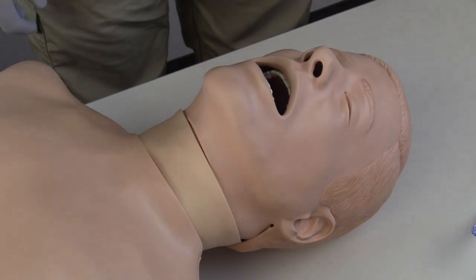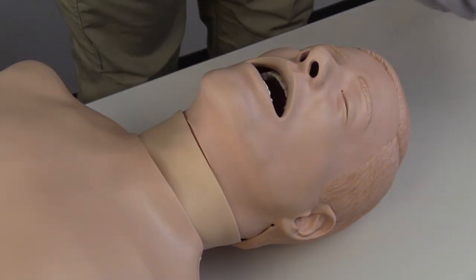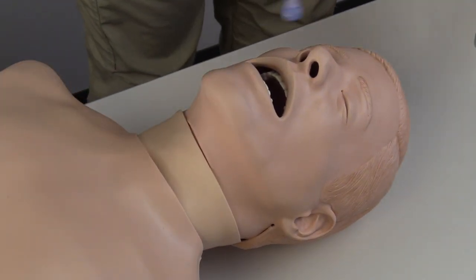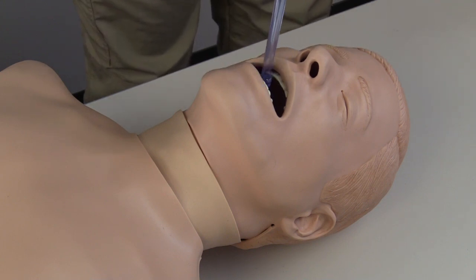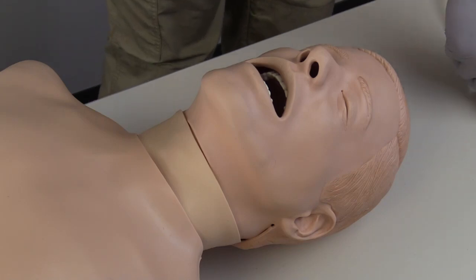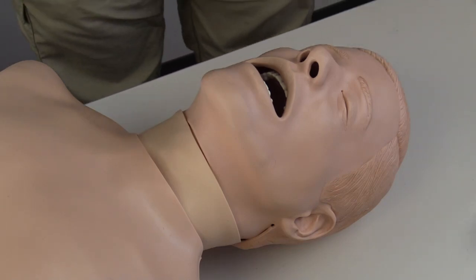I will next assess the airway for secretions or obstructions. In this case, the patient's mouth is full of secretions and management of the airway will require suction. I prepare my suction catheter and turn on the suction unit, ensuring there is proper suction pressure. I will insert the rigid suction catheter into the patient's mouth as far as I can see prior to suctioning, then apply suction while withdrawing and not exceed suction for more than 15 seconds.